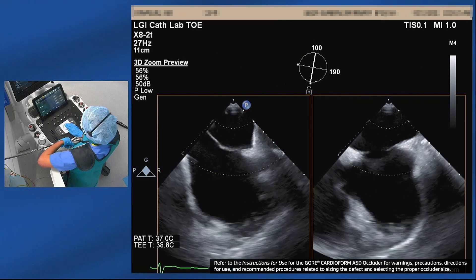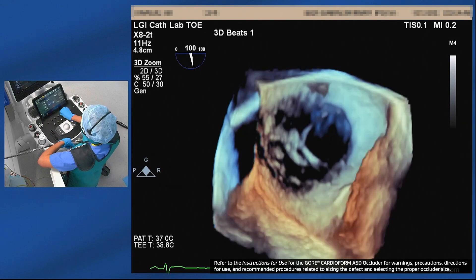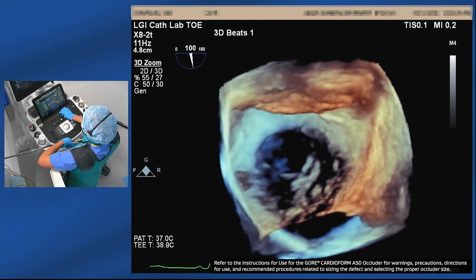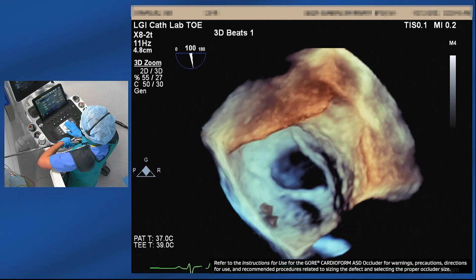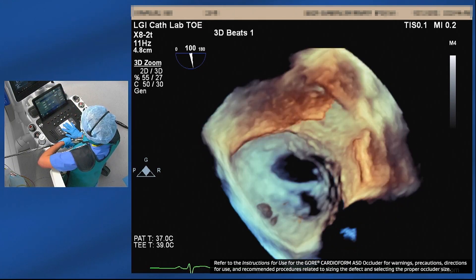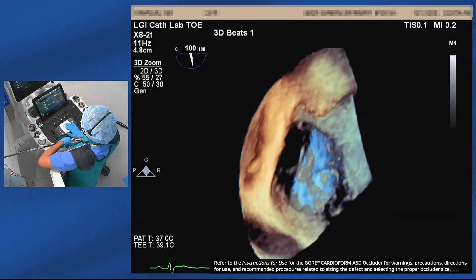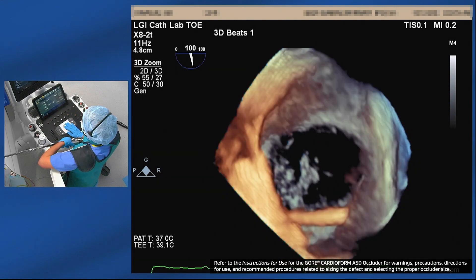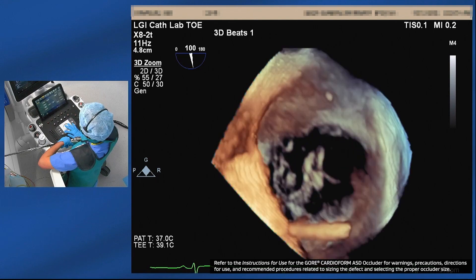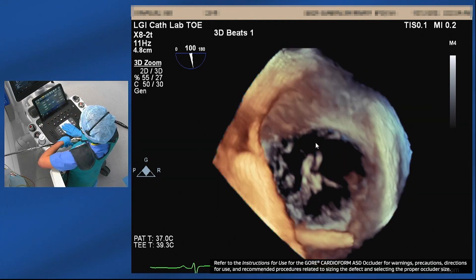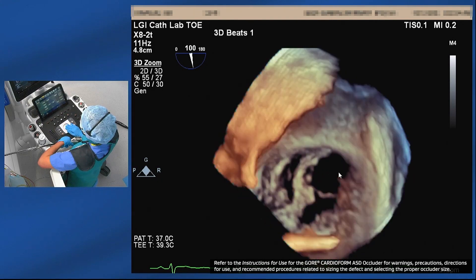The 3D view gives us a good idea of how the defect looks and confirms the position and size. It's an oval-shaped defect — this is the view from the left atrium with the pulmonary veins on top, largest dimension on the AP orientation. Looking from the right atrium with SVC at the top and IVC at the bottom, the largest dimension is about 16 to 17 by 12 millimeters.